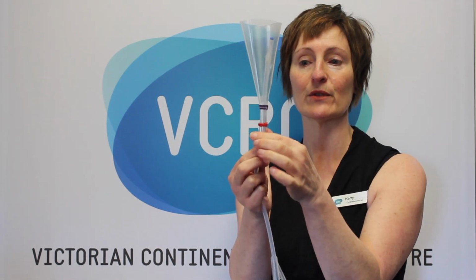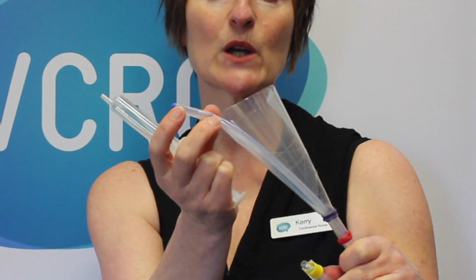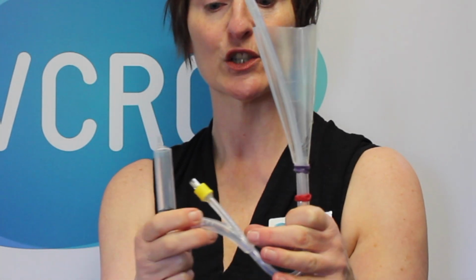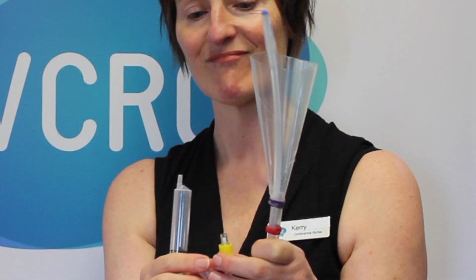Now with catheters, I'm going to show you how they go into the bladder. So we're going to pretend this is my bladder neck here and this is part of my urethra. So what actually stops the catheter from falling out of the bladder? So I need to inflate the balloon. There's a balloon here at the end of the catheter. So there's drain holes here on either side, and that's where the urine drains out through the catheter and into the drainage bag that connects into here, but that's a whole other education session.